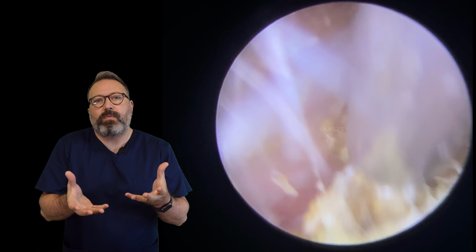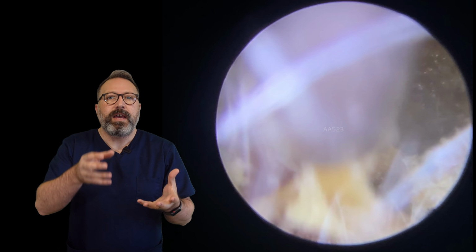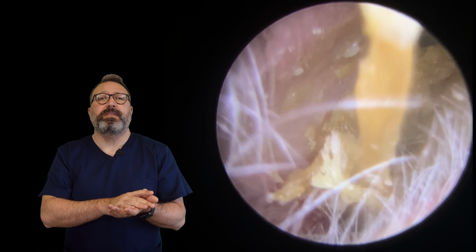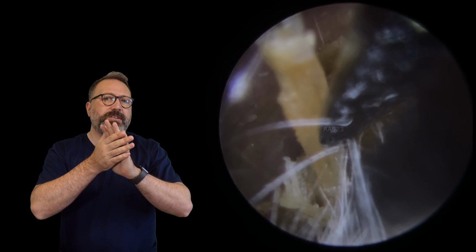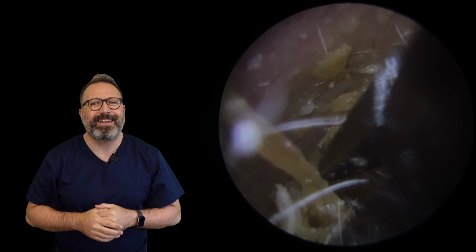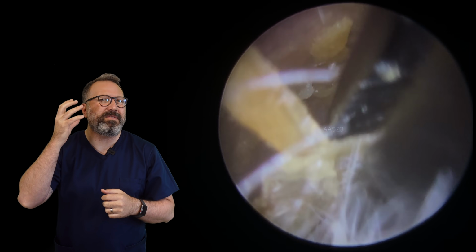Now when you've got this kind of wax issue here where there's lots of skin and other bits of debris and all sorts in here, then what you'll find is you will get layers that are stuck really firmly to the canal wall, and that's what this little bit of skin is here. When it gets sucked into the suction tube there, it just started to vibrate up and down really quickly, which is known as clarinetting. So it just makes quite a high-pitched squealing sound, which is not pleasant if it's in your ear canal.